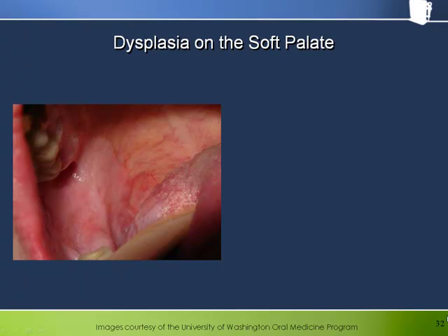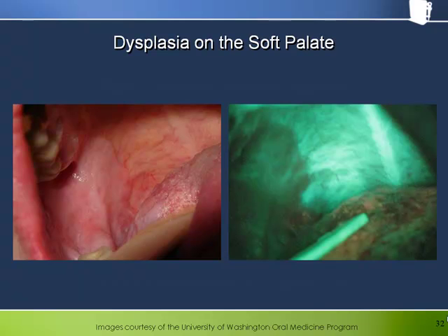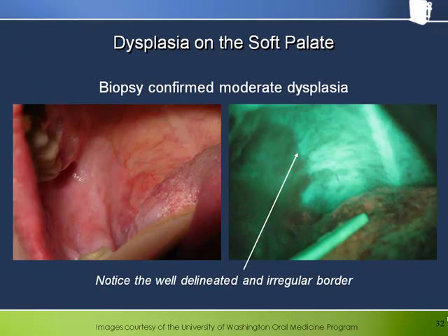This is an example of a large area of leukoplakia on the soft palate that was confirmed by biopsy to be moderate dysplasia. Under Velscope, the leukoplakia presents as a dark area in stark contrast to the adjacent healthy tissue on the soft palate. Notice in particular the well-delineated and irregular border of the dark region. This is typical of dysplasia and oral cancer.